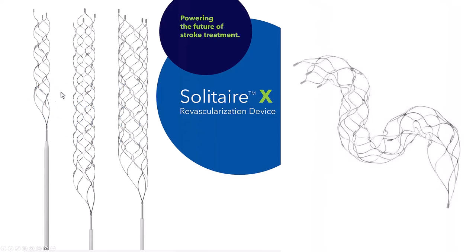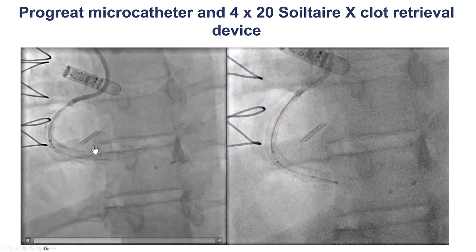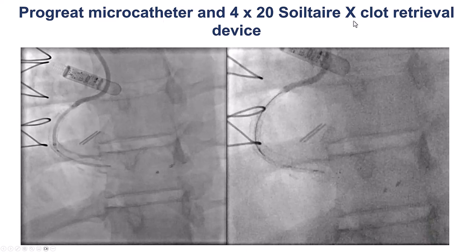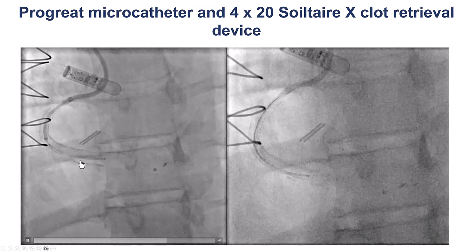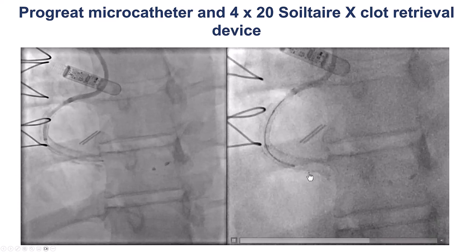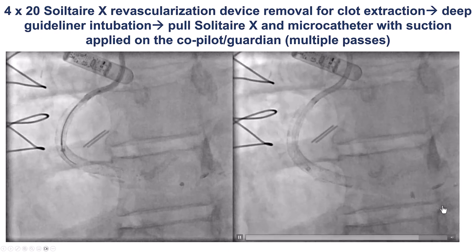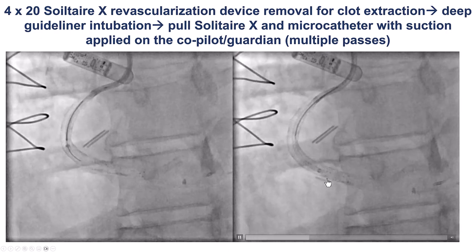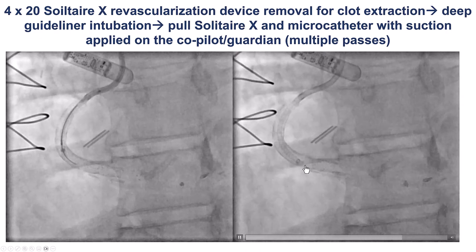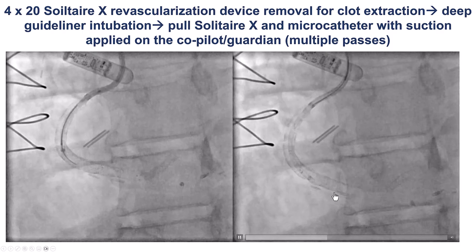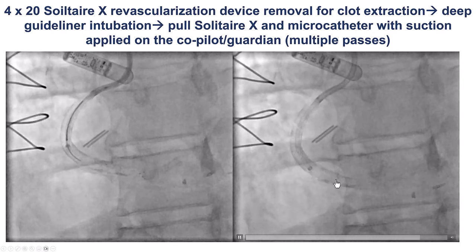We then used a device commonly used in stroke intervention: the Solitaire X, essentially a small nitinol mesh that can trap and remove thrombus — an off-label use in the coronary circulation. We used an antegrade microcatheter and then a 4 by 20 millimeter Solitaire X, deploying it inside the thrombus as seen by the markers on imaging. This did help — we retrieved some large thrombus pieces. We then did multiple aspirations using a guide extension catheter, a GuideLiner advanced deeply into the right coronary artery.